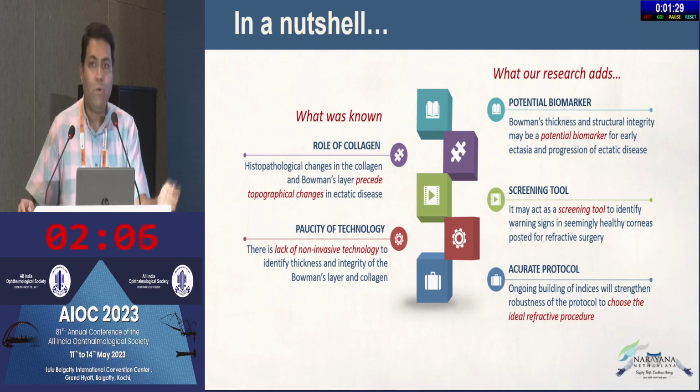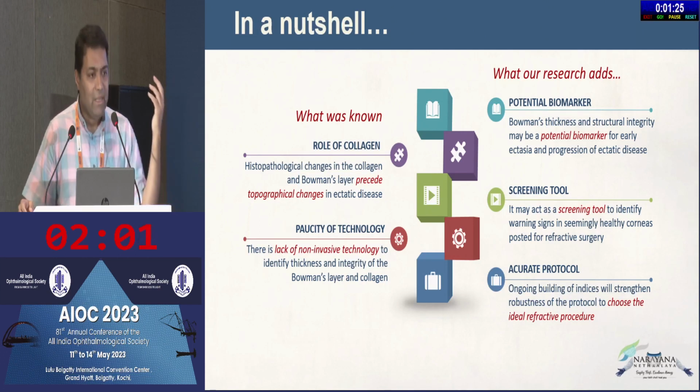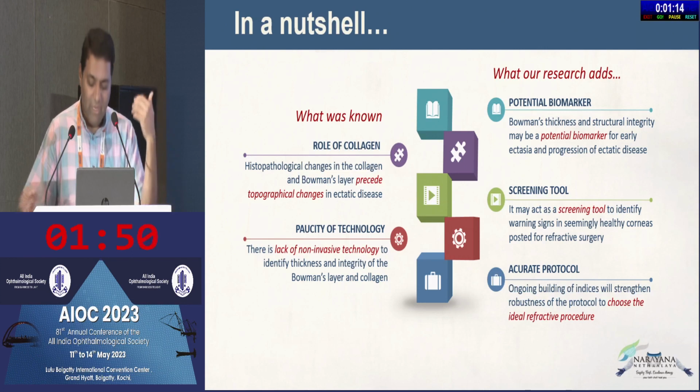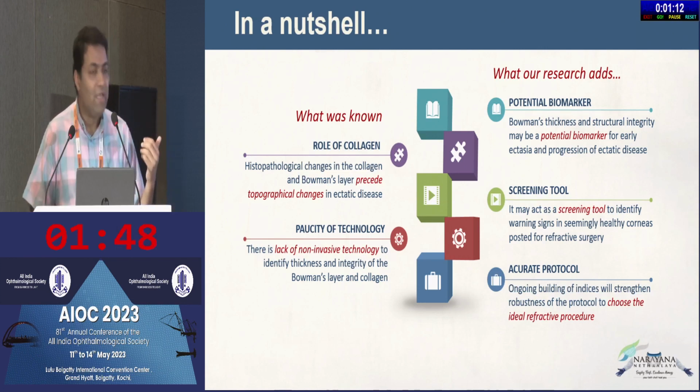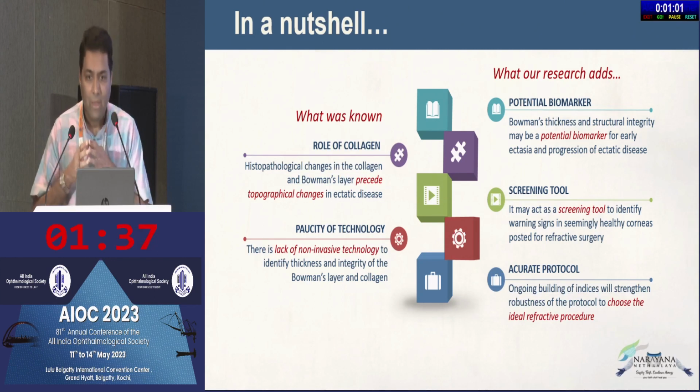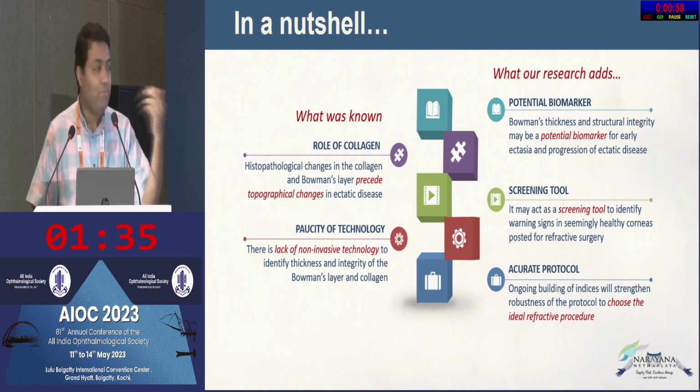And I keep quoting Dr. Sri Ganesh's paper, and he and Sheetal Brar had that big series of SMILE Xtra. But when you have a clinical paper, you need proof. And recently I was presenting in the SMILE Users Meet that the collagen changes after SMILE Xtra were completely different compared to what you get with just SMILE. So most of your clinical data needs proof, and imaging the collagen helps you to get that proof.